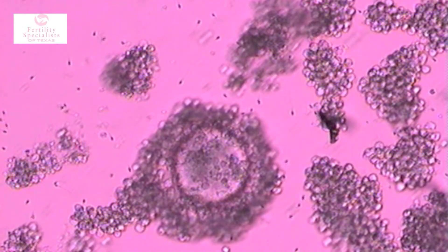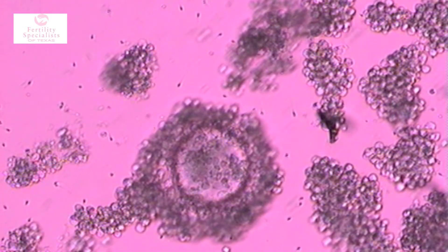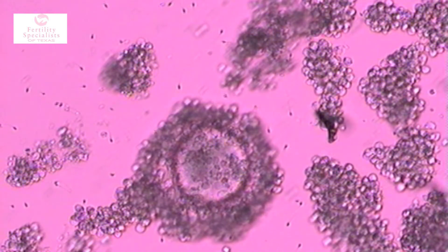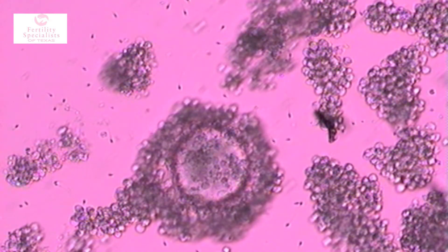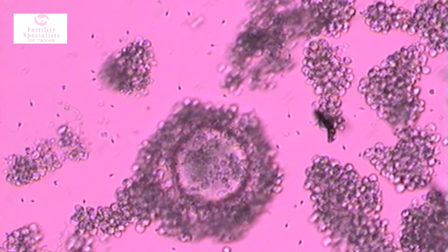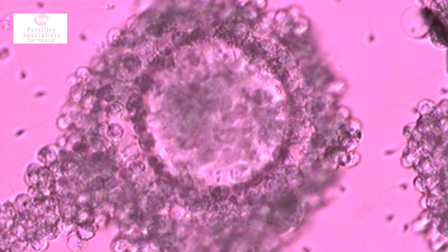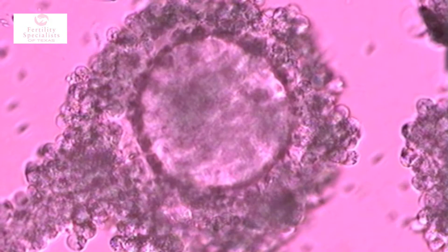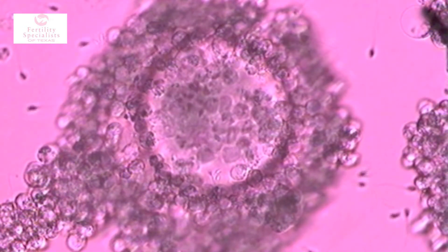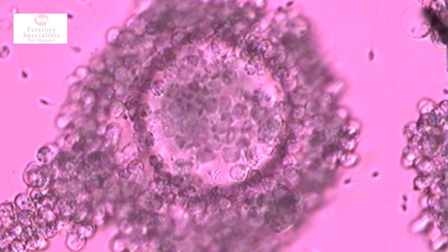The process of in vitro fertilization. We can see a human egg mixed with human sperm. Sperm are swimming around and binding the cumulus cells, or the cells outside the egg, trying to penetrate to fertilize.